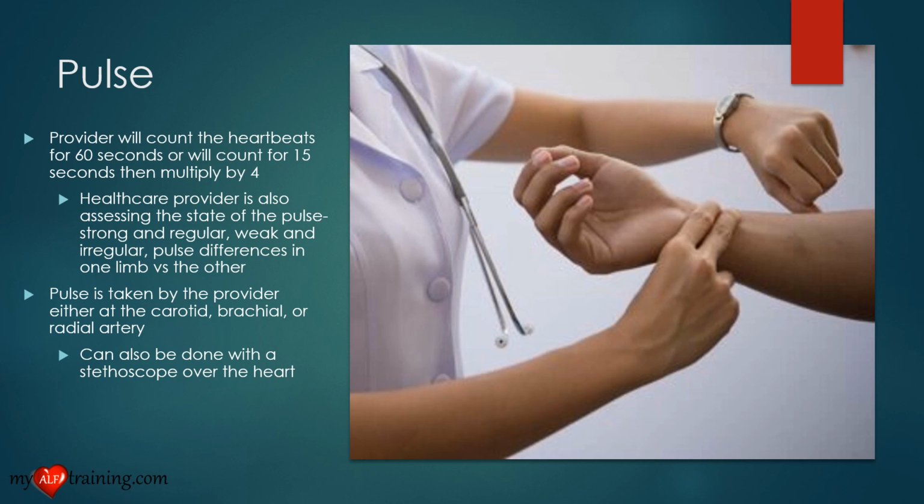The pulse is taken by the provider either at the carotid, brachial, or radial artery. Pulse can also be taken by simply placing a stethoscope on the chest over the heart.